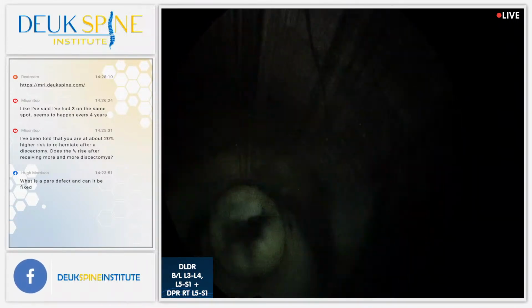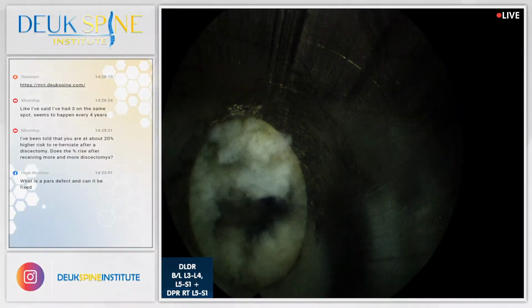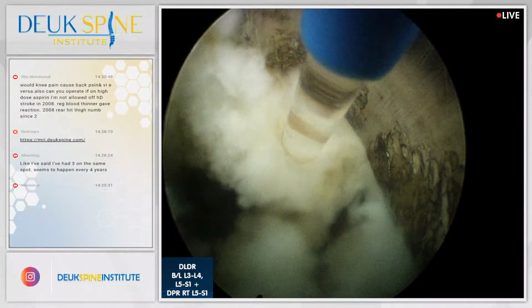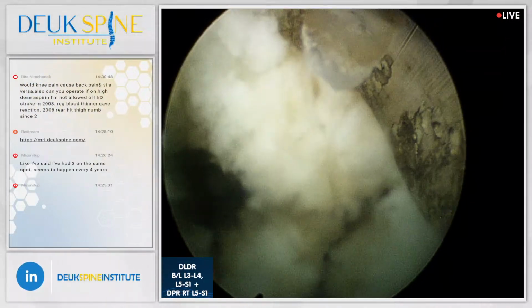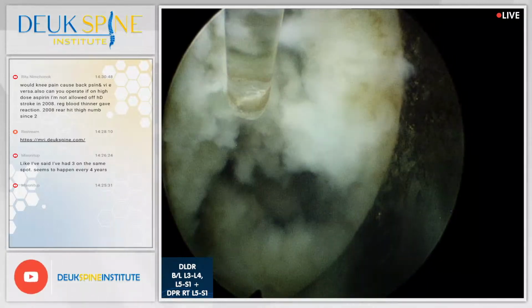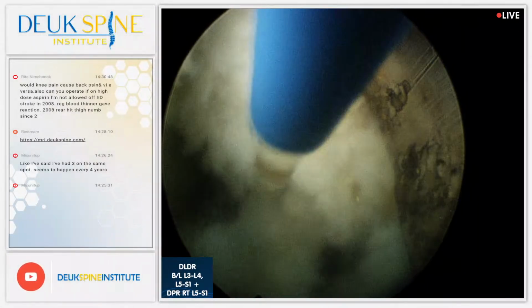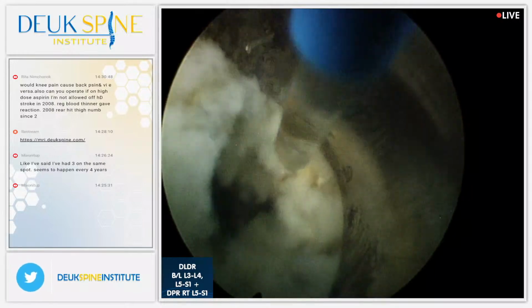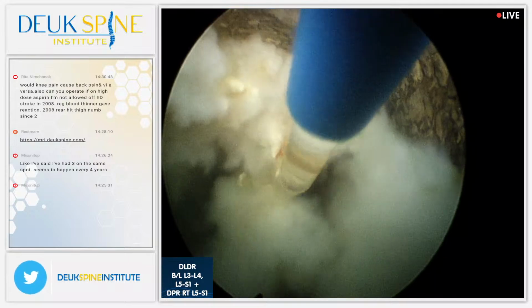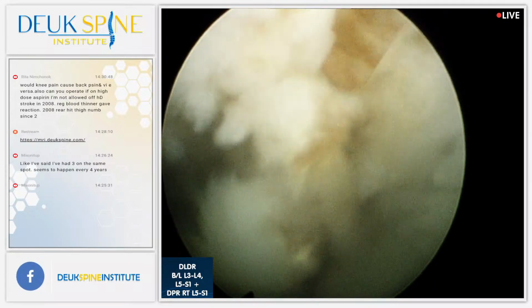Let me get that laser one more time. Any more questions? At this moment, no current questions. Now we're not going to restream with the right. Come on, Nikki. It's because you turned it on after I pushed the pedal. You've got to be ready. When you see me grab the laser fiber, that's your clue to turn it on. Can't get distracted. All right, go ahead, Henry.